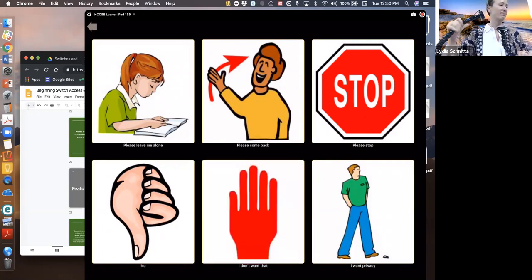I don't want that. That was confusing. So no, no, yes. Please leave me alone. Modeling that self-talk is part of the training, and it helps with the one-to-one correspondence that I was talking about earlier.